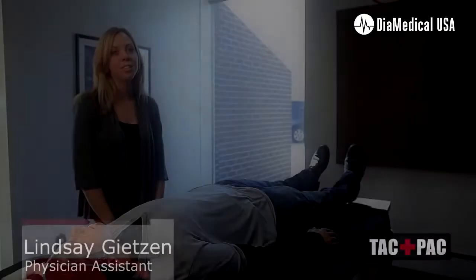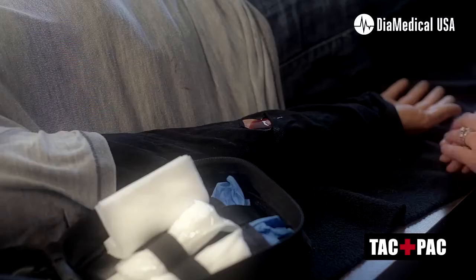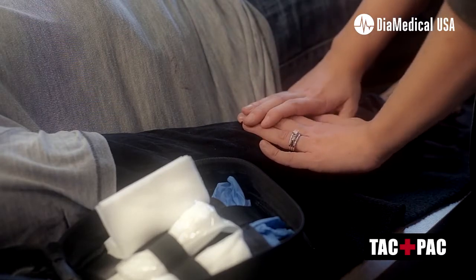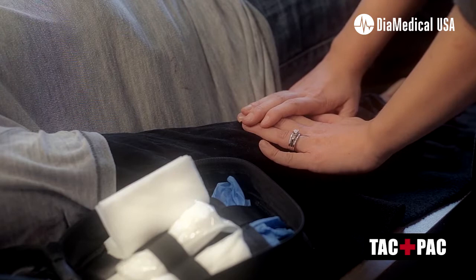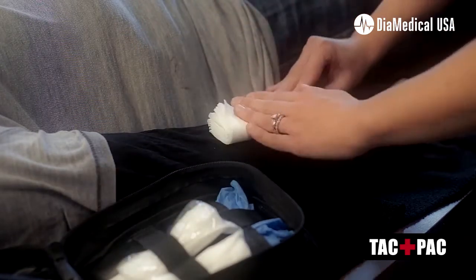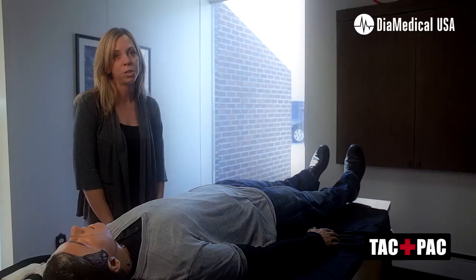When someone is bleeding, you first need to decide where the bleeding is coming from. Once you've determined where the wound is, you want to place firm, direct pressure over the wound with your hands. If the bleeding continues, you can reach into your attack pack and grab gauze to place over the wound, holding firm and direct pressure over the wound.